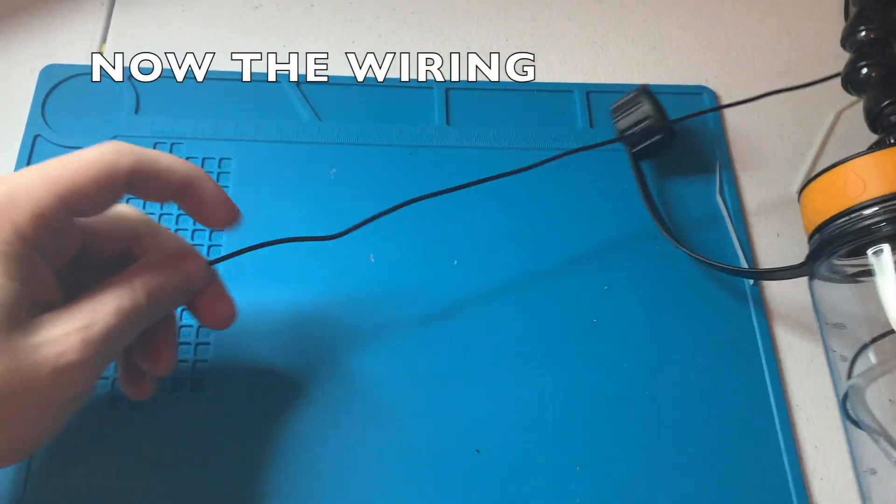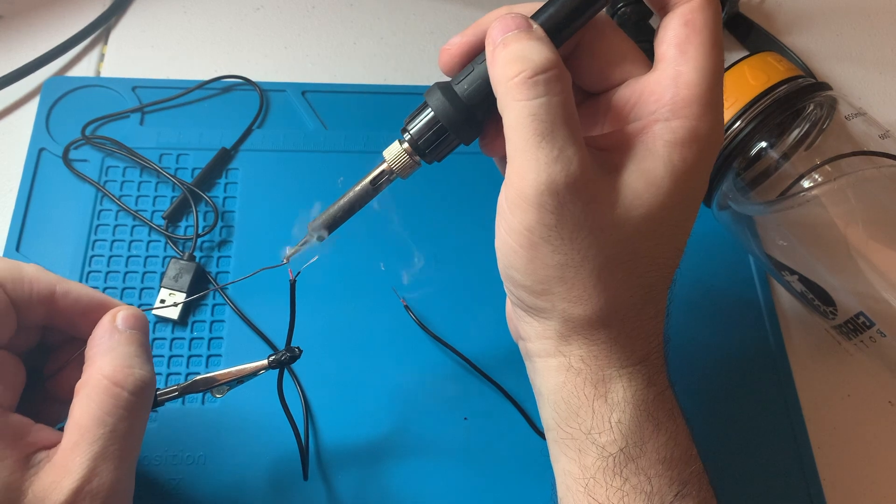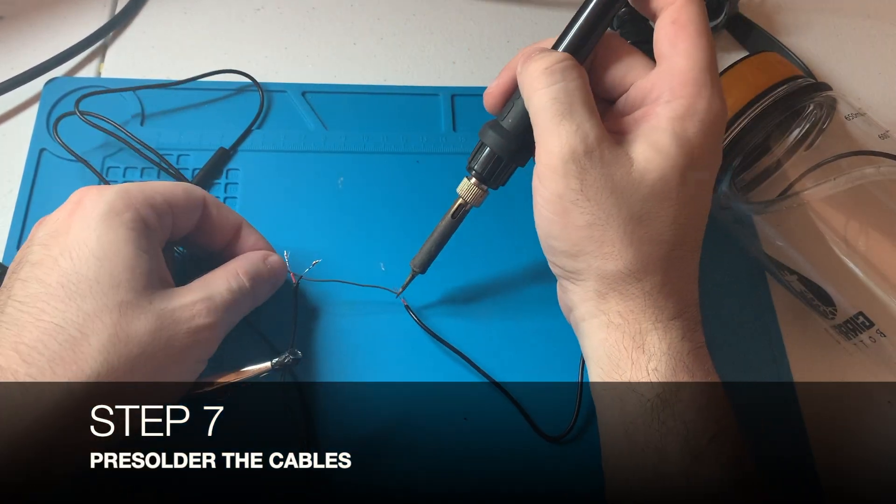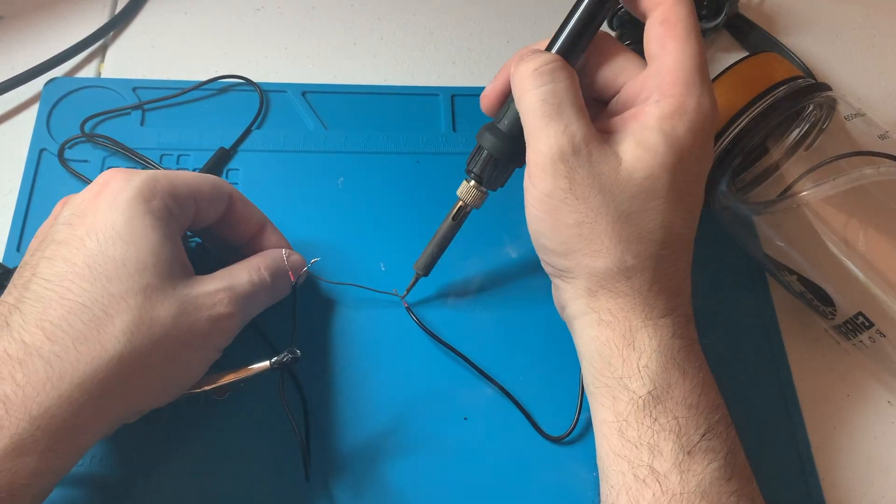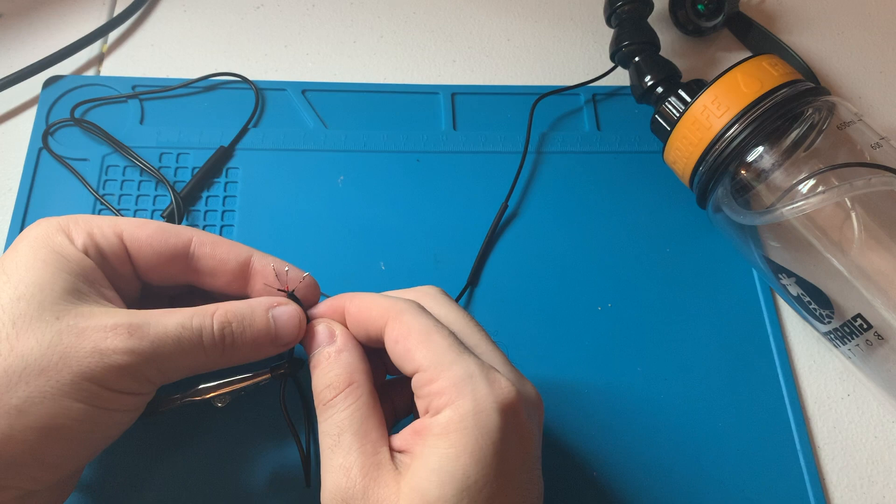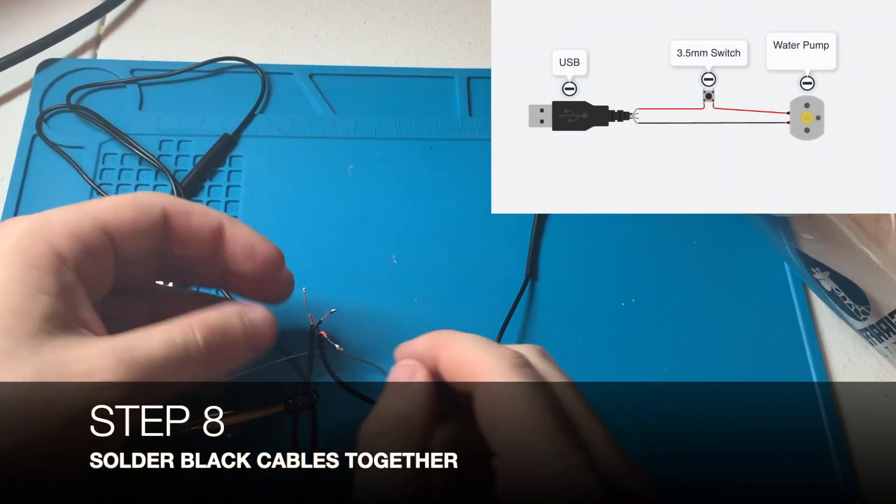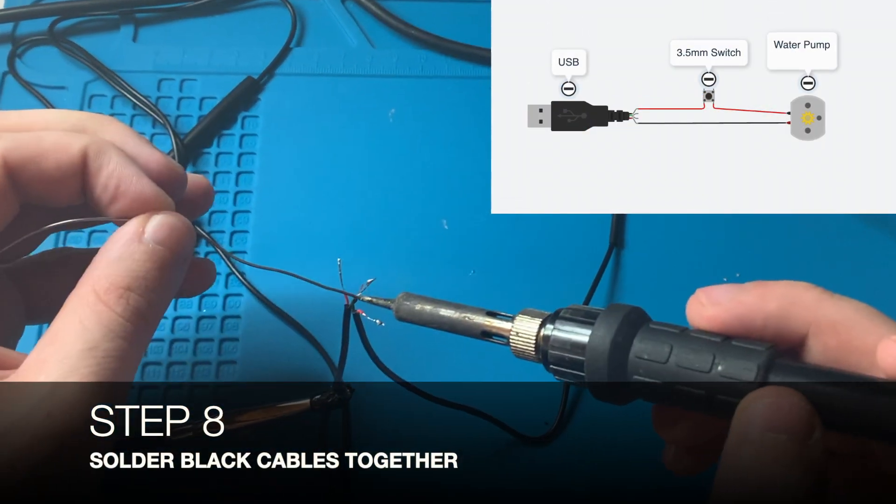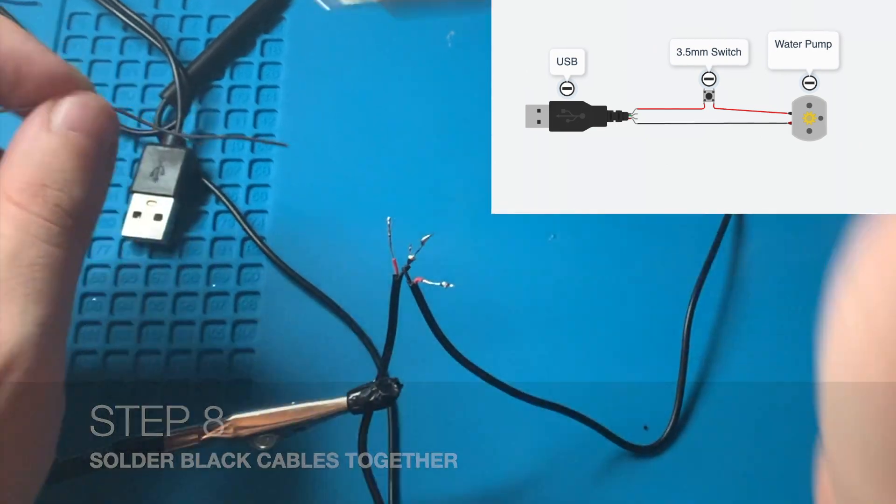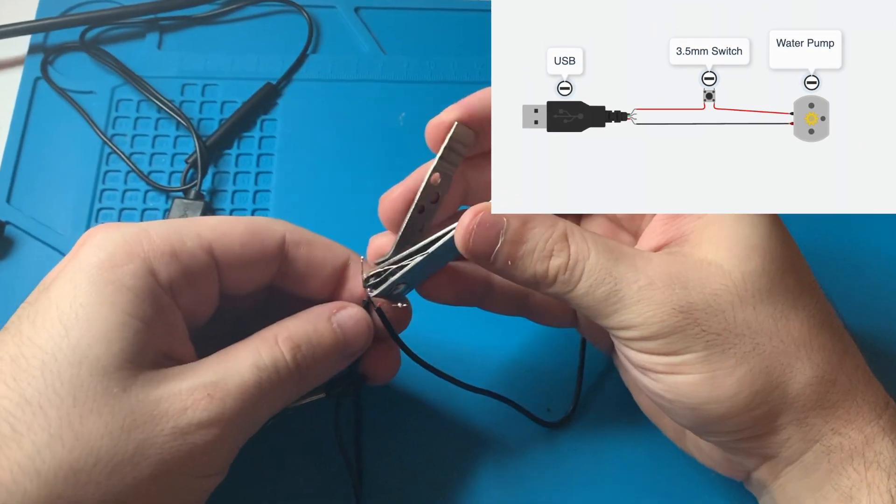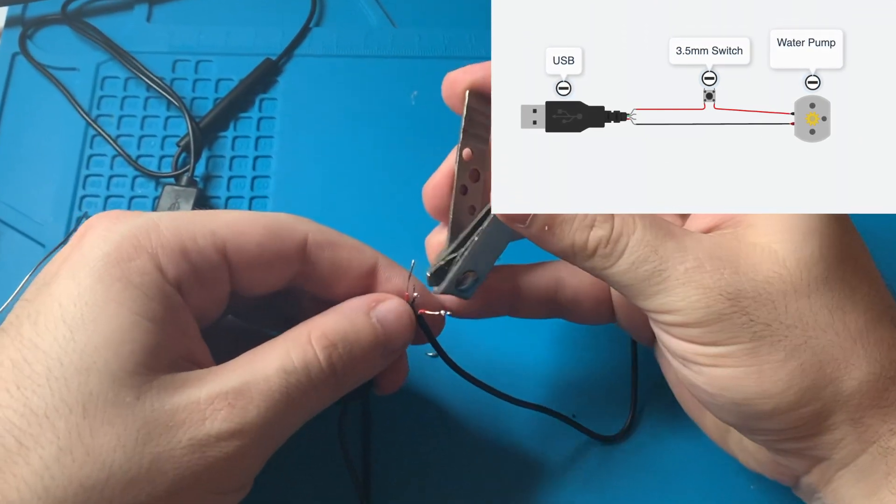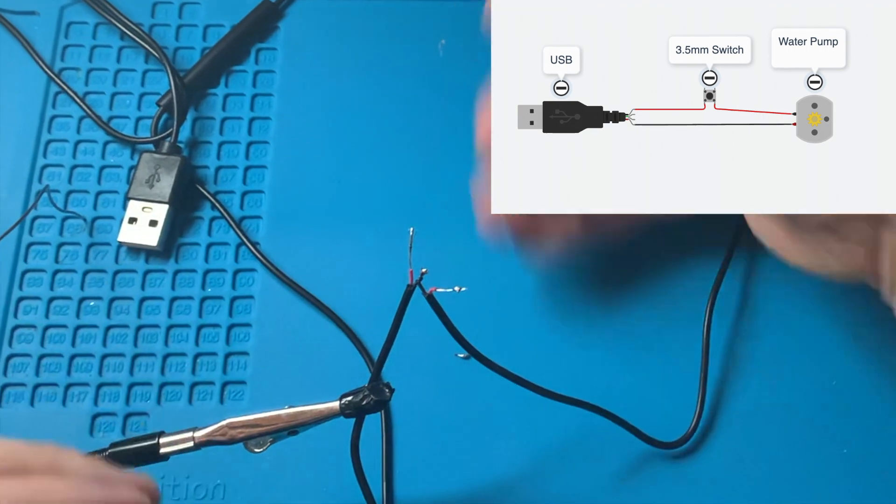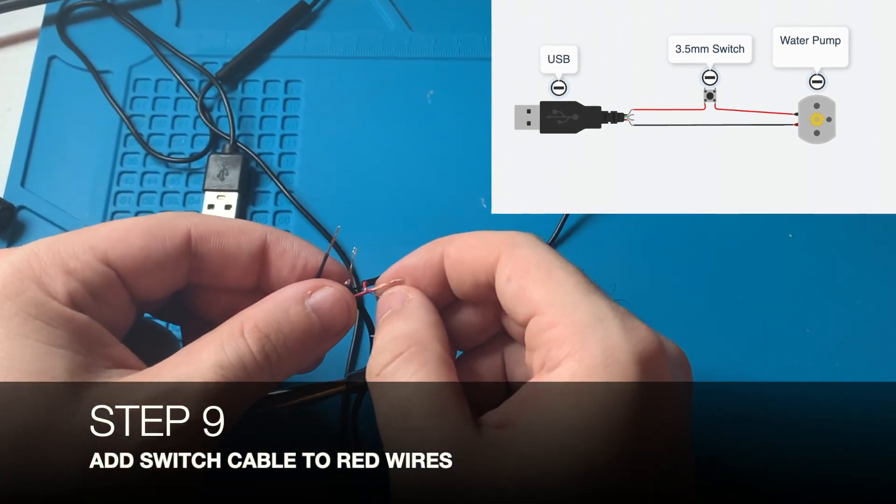Over here you can see I stripped the wires. This is the part that connects to the USB. I'm just going to pre-solder it just a little bit. There's a black and a red wire—the main thing is just to connect two of the same colors. So here I'm connecting the black one to the black one, and I'm going to solder those two together.